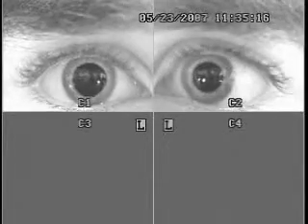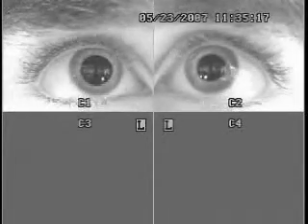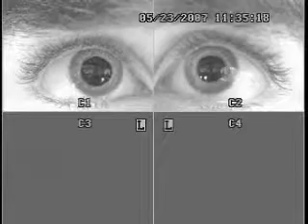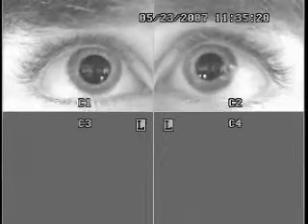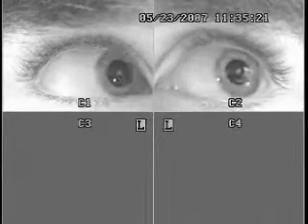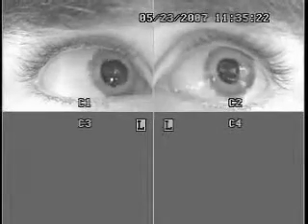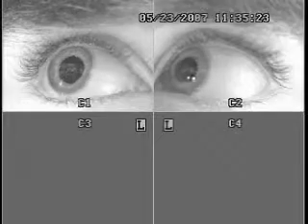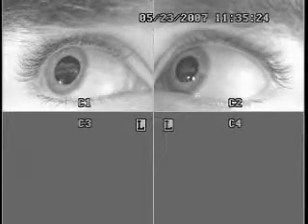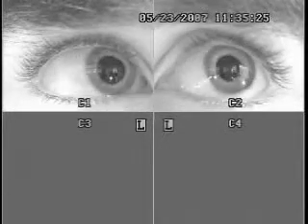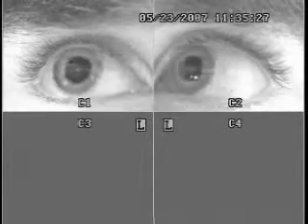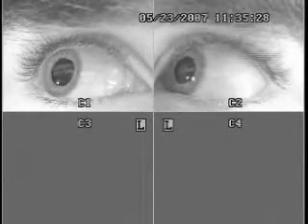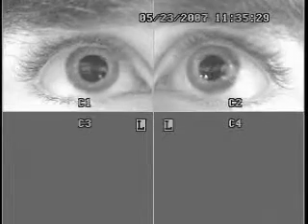Second pre-test is to check for equal tracking. Can you see the stimulus right there? See the bead? Just follow it with your eyes. We're just checking to see that both eyes move together and that they have full range of motion. And, in fact, they do.